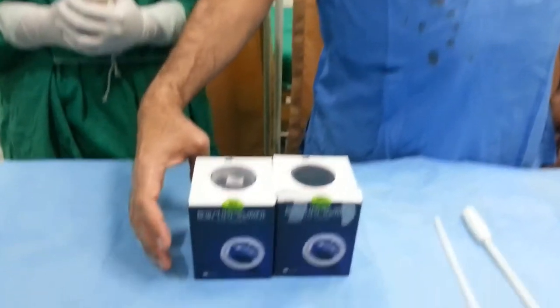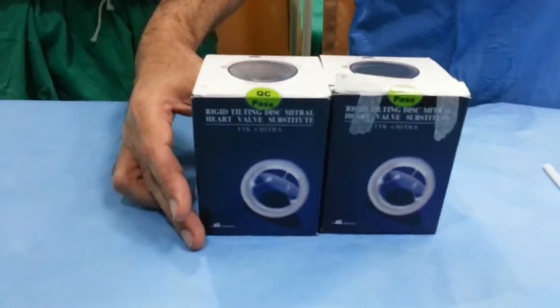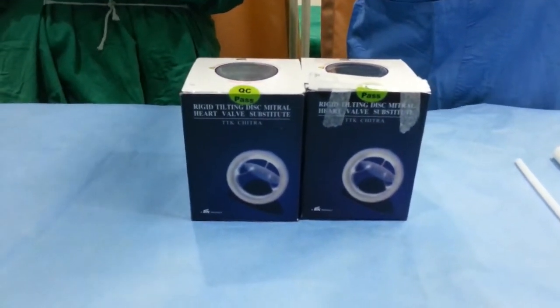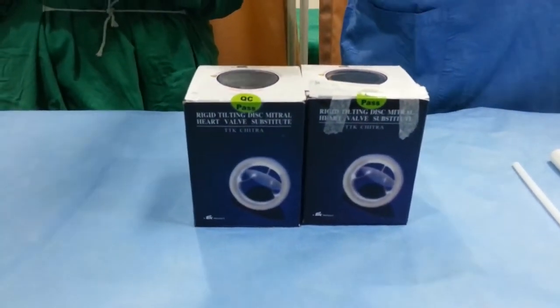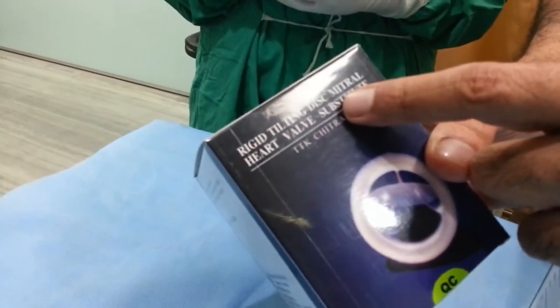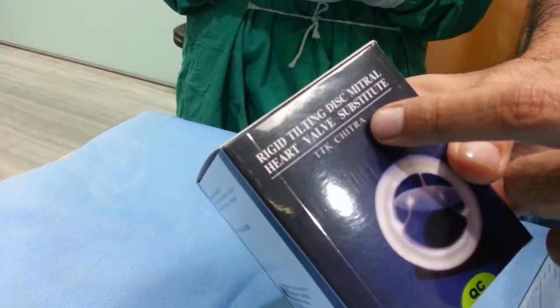Today, we are going to try and explain to the nurses how a valve is presented to the surgeon when he asks during a valve replacement. The demo will be done for a TTK Chitra rigid tilting disc mitral valve.